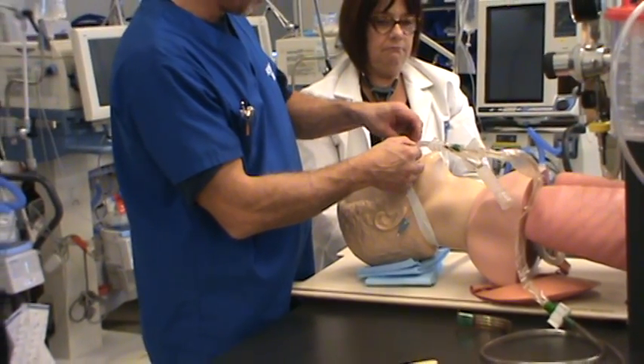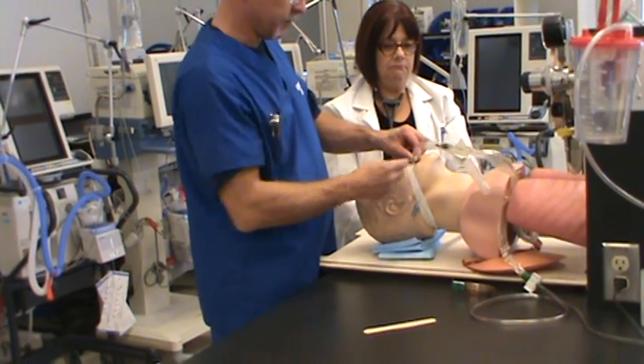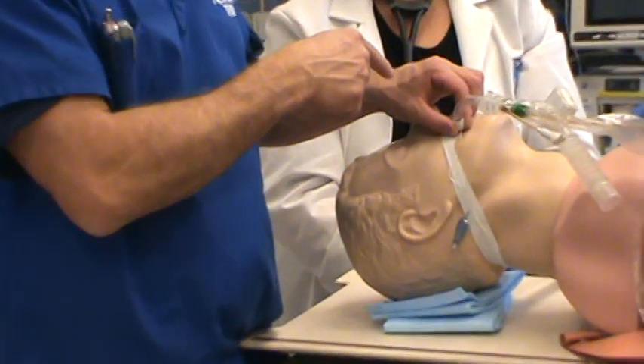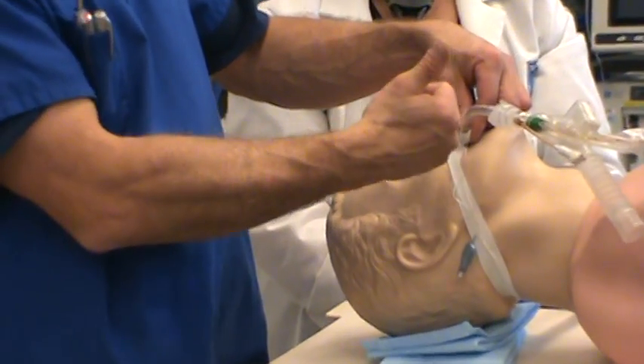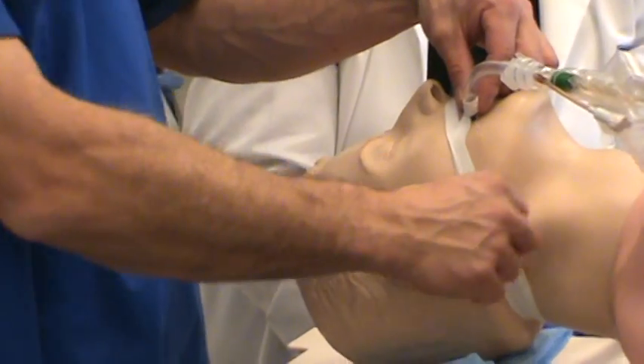Go around the tube a few times — three should be enough. The tape is done on the right-hand side: bottom top, top tube. The pilot balloon line is not taped to the tube; it's got free and easy access.